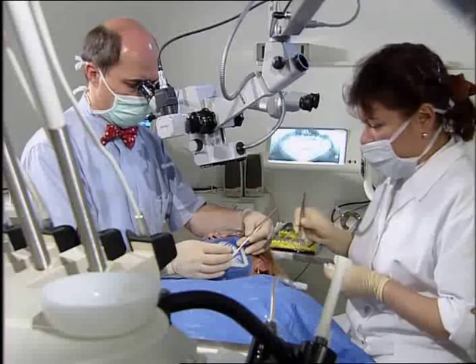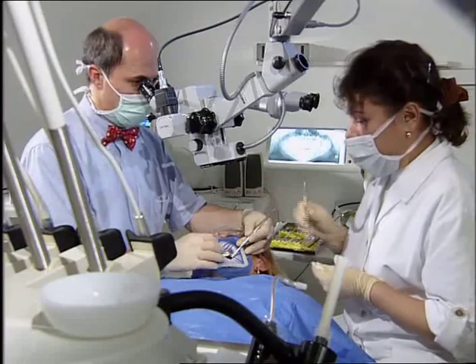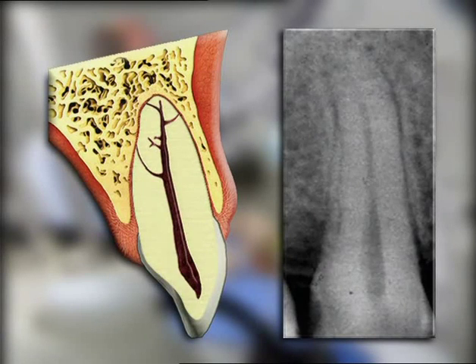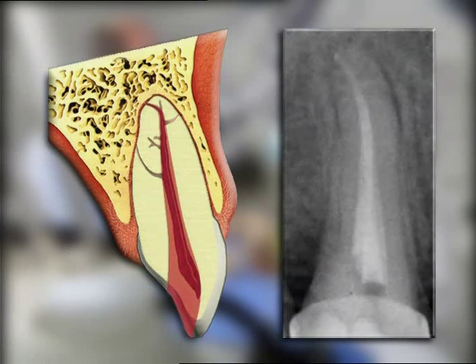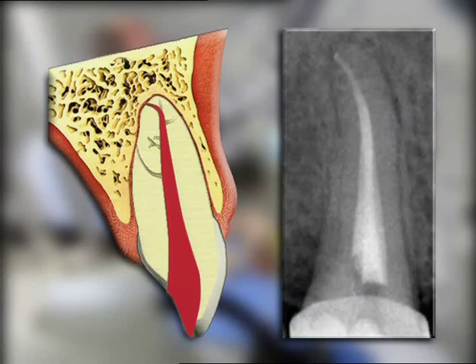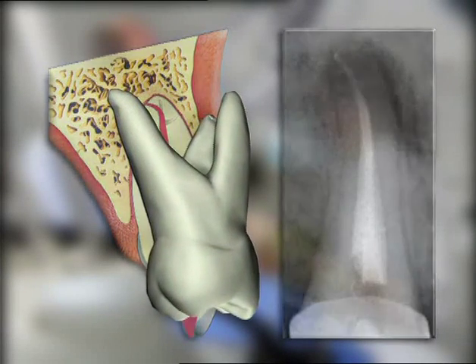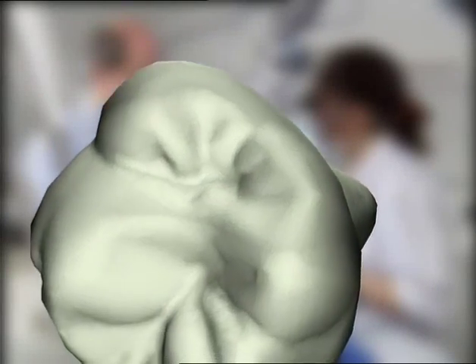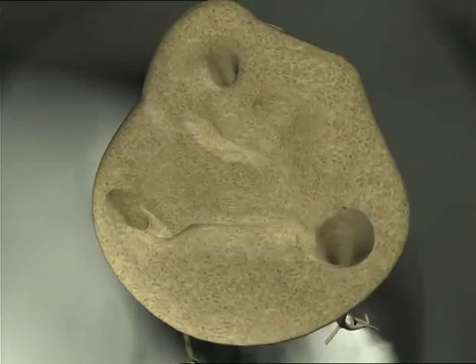Herbert Schilder taught endodontists to think in the third dimension. His five mechanical objectives for successful cleaning and shaping were first introduced in 1974. A continuously tapering conical form is developed with the narrowest cross-sectional diameter at its terminus. The root canal preparation should occupy as many planes as are presented by the root canal system, that is, multiple planes. This objective preserves the natural curve or flow.